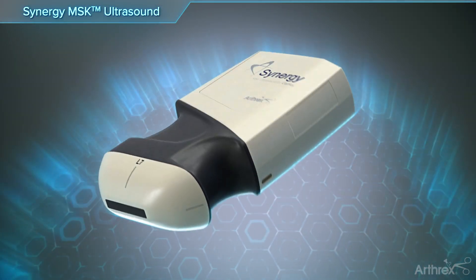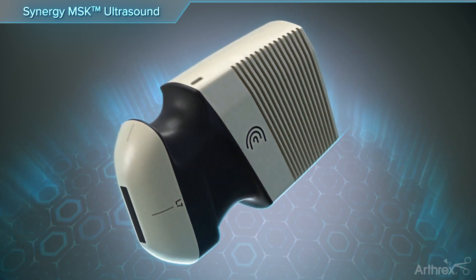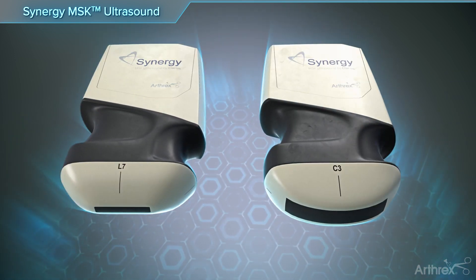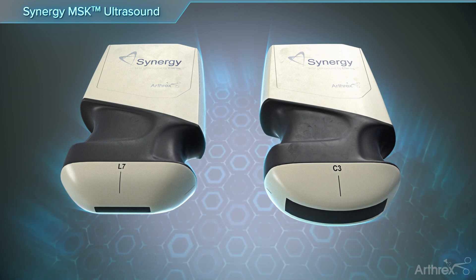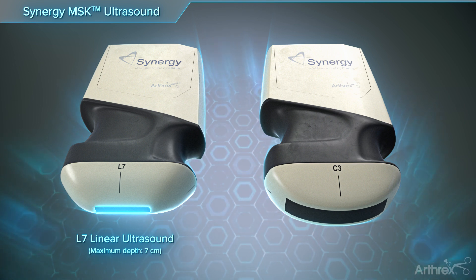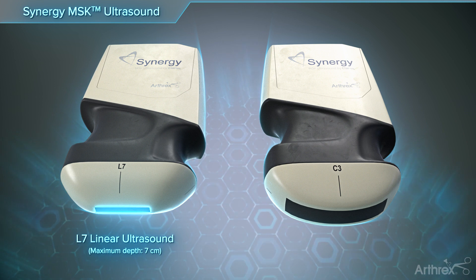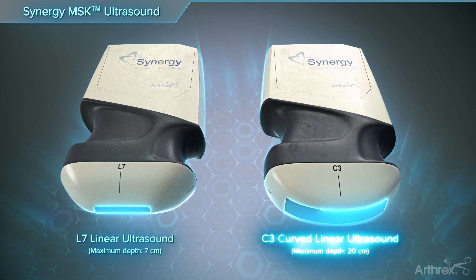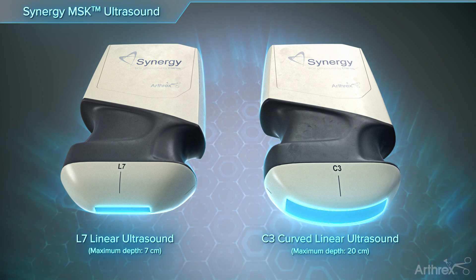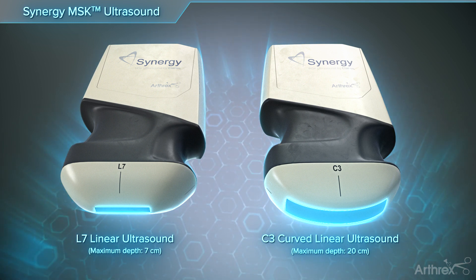The Arthric Synergy MSK Ultrasound is a dynamic imaging modality with limitless portability. The Synergy MSK Ultrasound features two scanner options: the L7 and the C3. The L7 is a high-frequency linear scanner producing high-resolution images for superficial scanning from skin level to a max depth of 7 centimeters. The C3 is a low-frequency curvilinear scanner that provides the ability to scan deeper structures to a max depth of 20 centimeters with a wider radius of view.